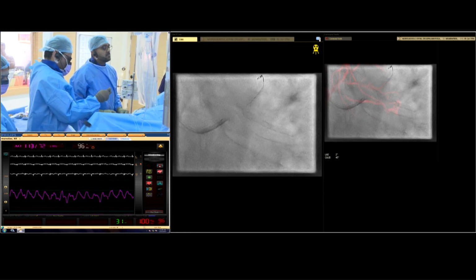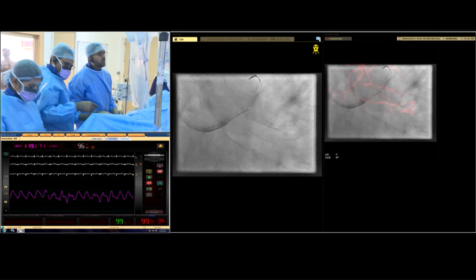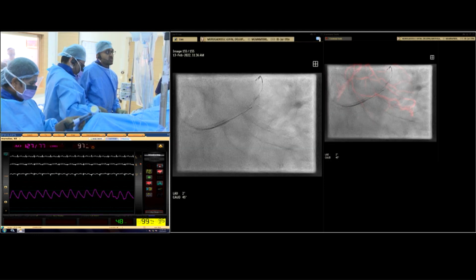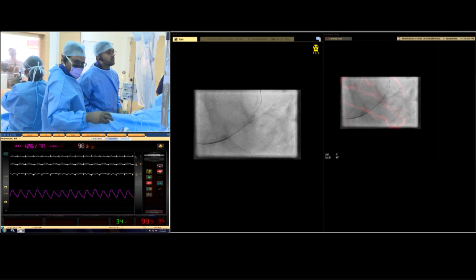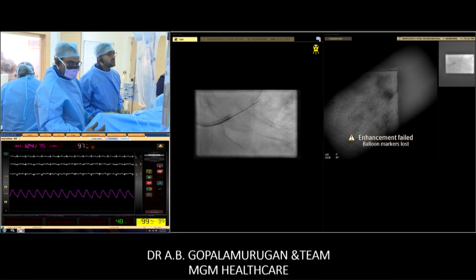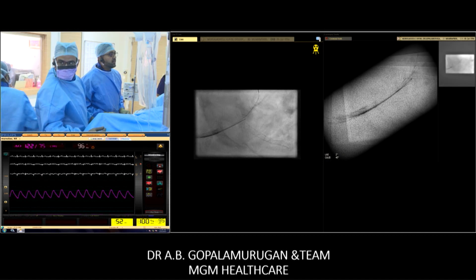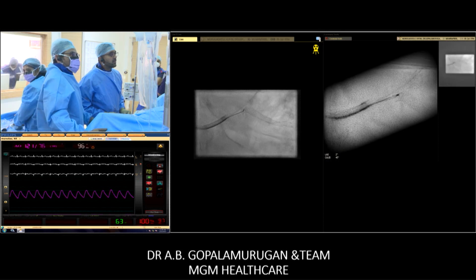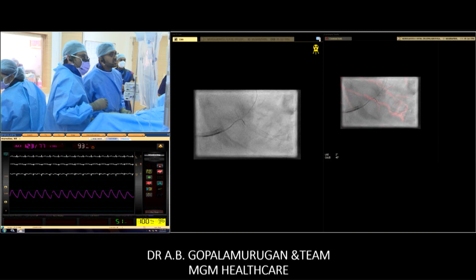Okay. May I talk, please? Cone down, super mag, all the way. Just need to see the stent. So the intention is to cross somewhere sort of mid, so we'll see where we end up. It's somewhere in the mid, but some resistance. Let's see.